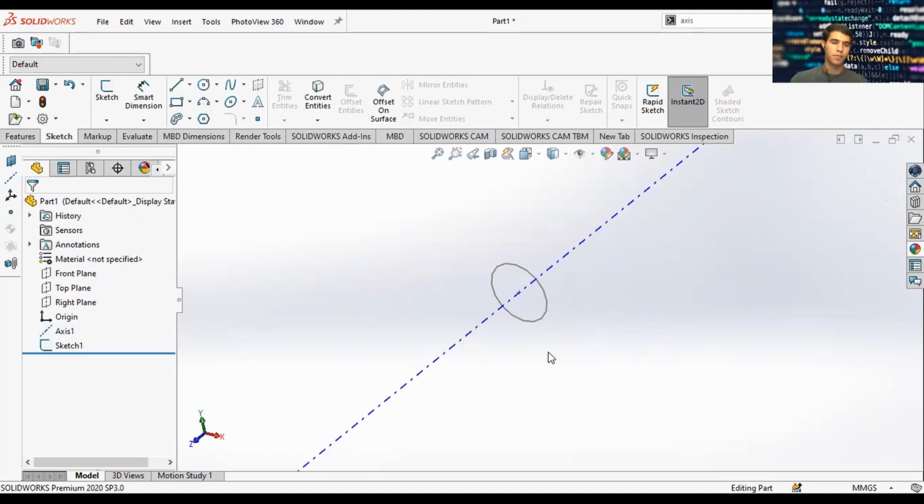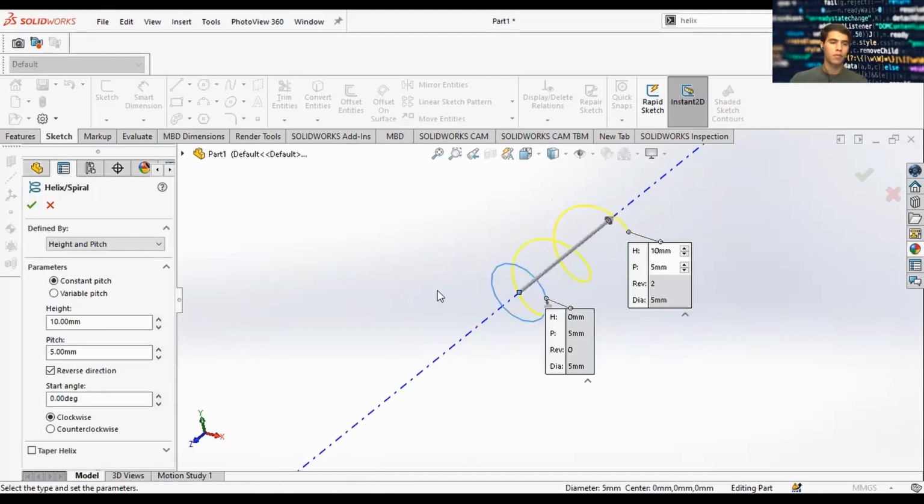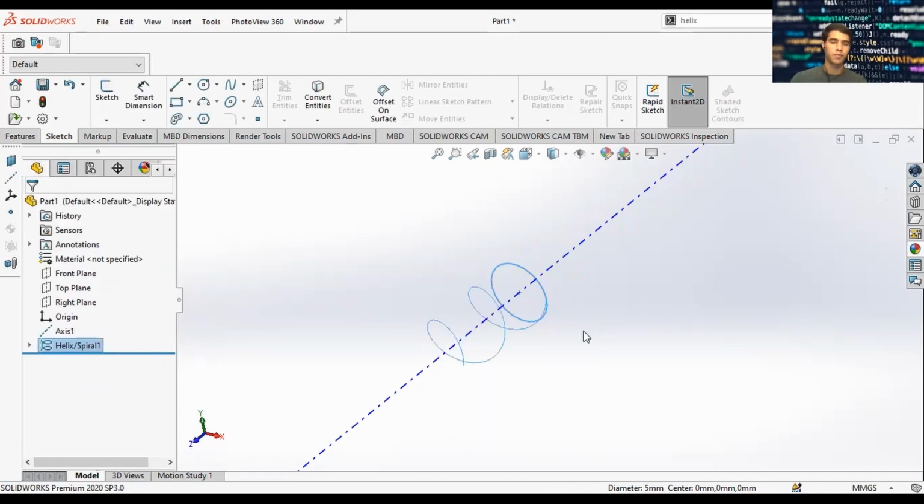What's next? Next, we want to simulate the helical spiral of the embolization device. We look for a helical spiral, and we create our spiral based on height and pitch, because we know the height is 10 millimeters, and the pitch can be controlled to whatever you want. Reverse direction, clockwise or counterclockwise, and you're good to go.